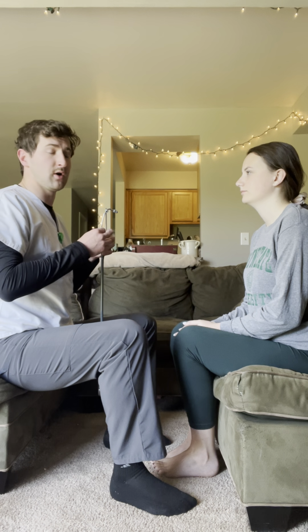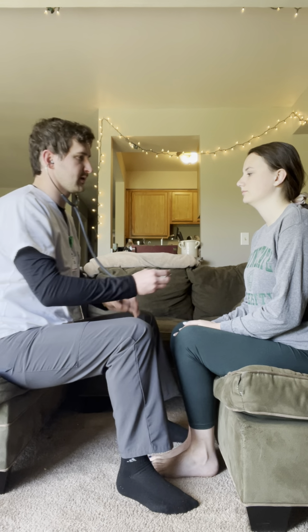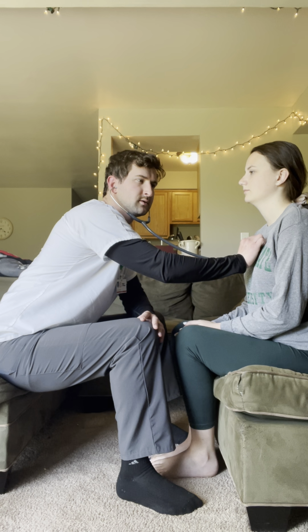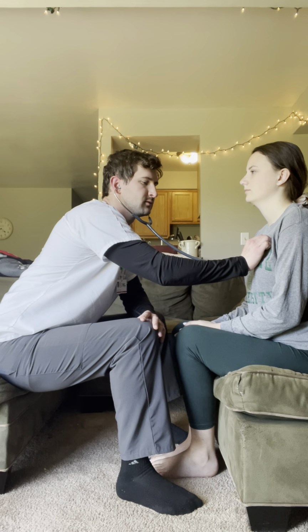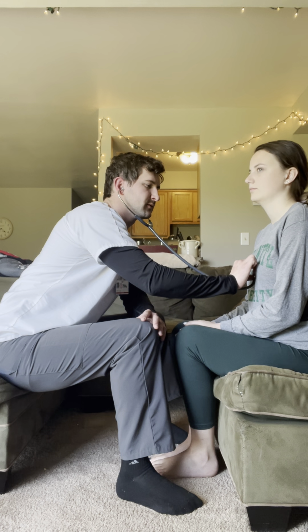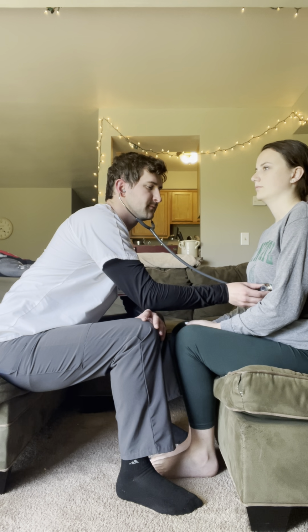From there, I'm also going to auscultate each of the heart areas that you can just breathe normal for me. Let's start over here, the aortic, pulmonic, Erb's point, tricuspid valve, and the mitral valve.